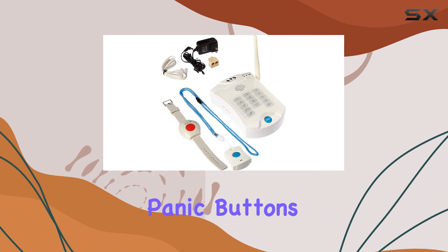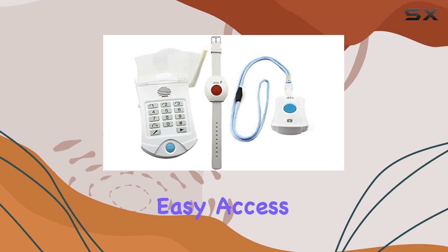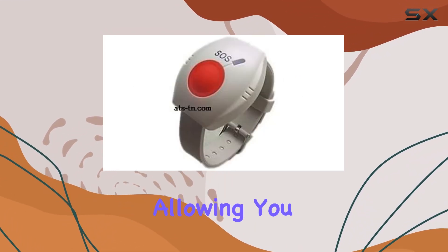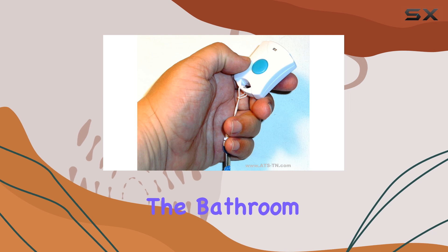The package includes two panic buttons: one wrist panic button and one necklace panic button, ensuring you always have easy access to help when you need it most. The wrist panic button is water resistant, allowing you to wear it while showering or bathing, which is a significant advantage for those who may be at risk in the bathroom.